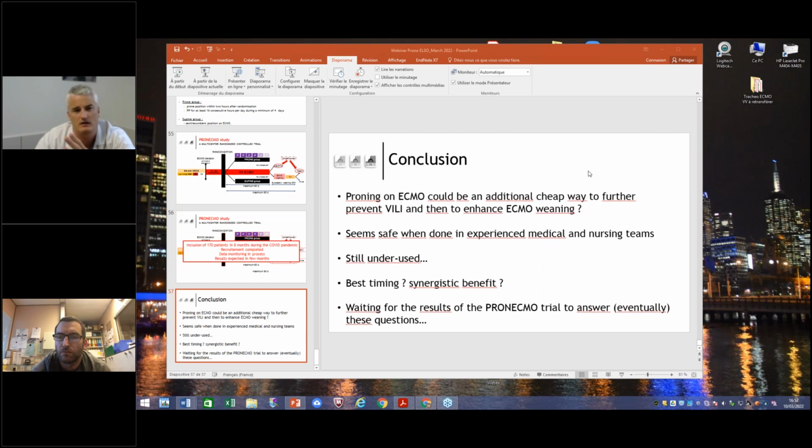In that case, I think thinking about prone positioning is too late. That's why we don't prone patients with a tracheostomy on ECMO. There's a question on the frequency of bleeding with prone positioning. That's something that we don't really see. Of course, if we already have an issue with the cannula, we may consider not proning, or at least trying to adjust for the place where we have the bleeding.